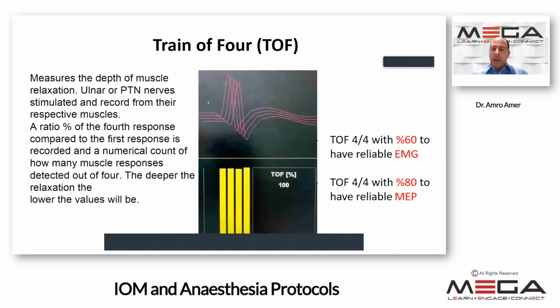So starting, I'm just going to talk quickly about a few tests, and then we'll talk about what drugs affect those tests, generally speaking, and then the physiological parameters that affect our signals.